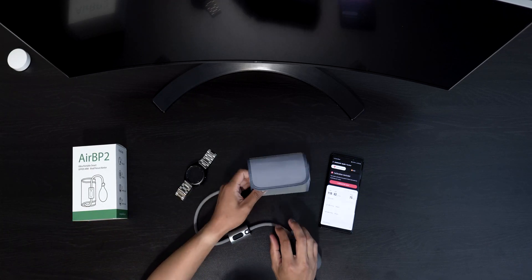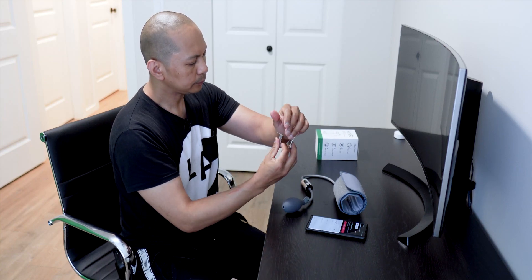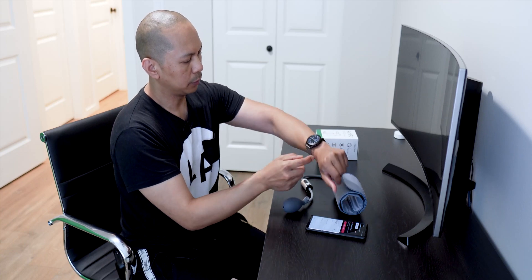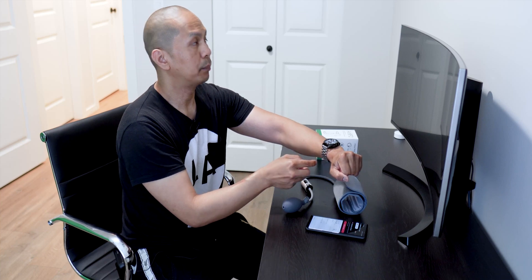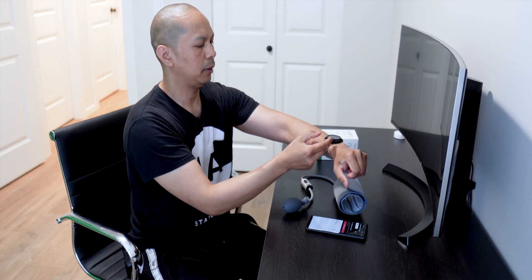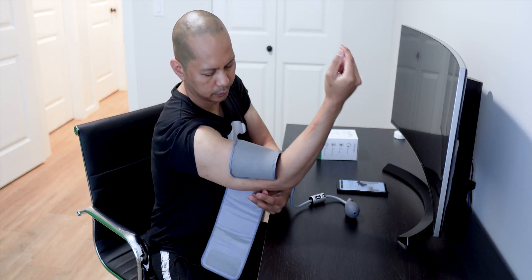Let's do the calibration. I'm going to put my watch on here and make sure it's right above the wrist, perfectly aligned — just right up there. Here we go.